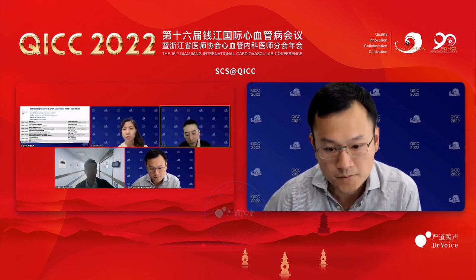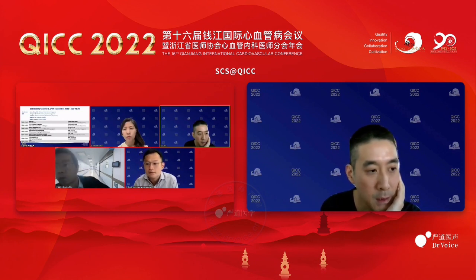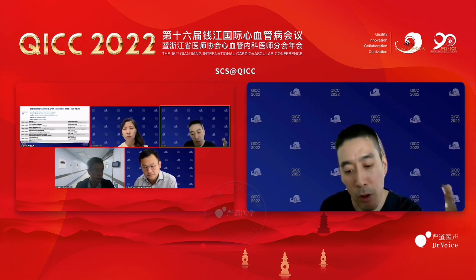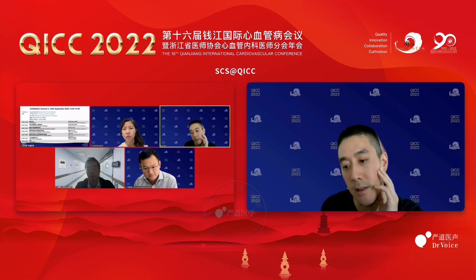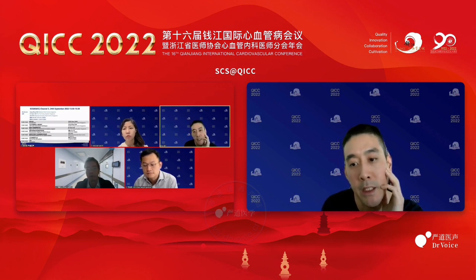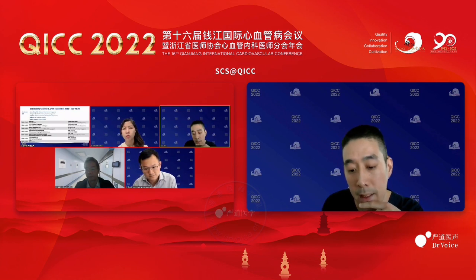Yeah, so I think it's really looking at the gradients. I think it takes a bit of experience, because when I first started out, sometimes with a little small gradient, you think it's a gradient, then you go on to fix it. But actually you realize that for anything to really make a change, you need a big enough jump. So when you do the pullback, you should find a big enough jump. And as I mentioned earlier, some do recommend a pressure gradient drop of 10 millimeters mercury. So I think that can be a good number to go by.